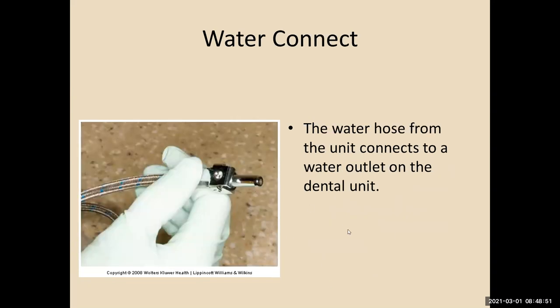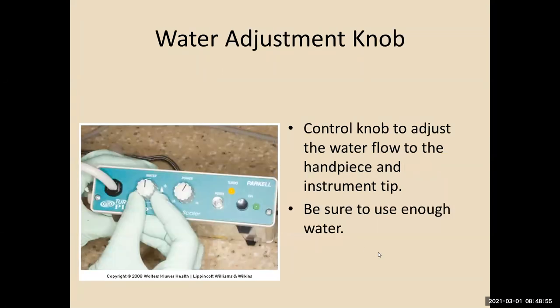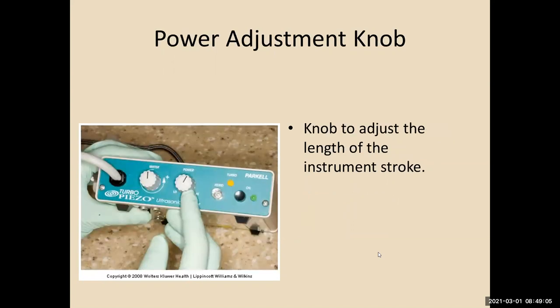Quick connect. Control knobs. Again, you want to be sure you're using enough water, because water is the coolant. Power.